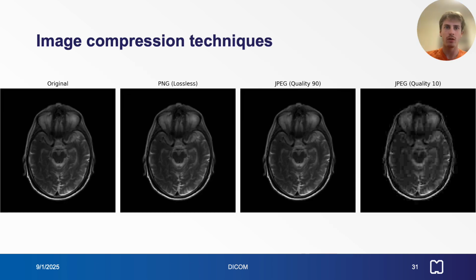The massive amount of data in radiological studies poses considerable challenges regarding storage and transmission. Image compression reduces the number of bytes in an image or set of images, thereby decreasing the time required to transfer images. When stored or transmitted in uncompressed form, digital images occupy an amount of space proportional to the matrix size of the image. However, images typically contain a significant amount of redundant information that can be represented more compactly.